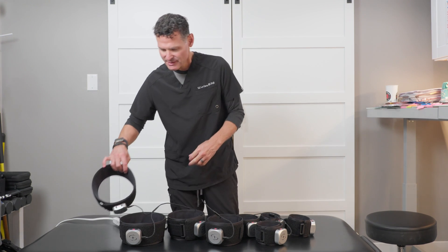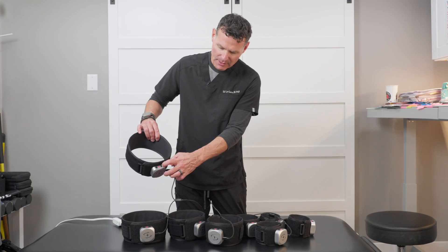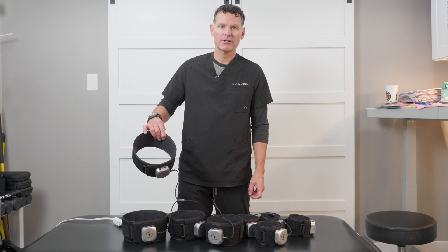When you're charging them, you'll notice that a light will come on. Once that turns green, that means the unit is fully charged.